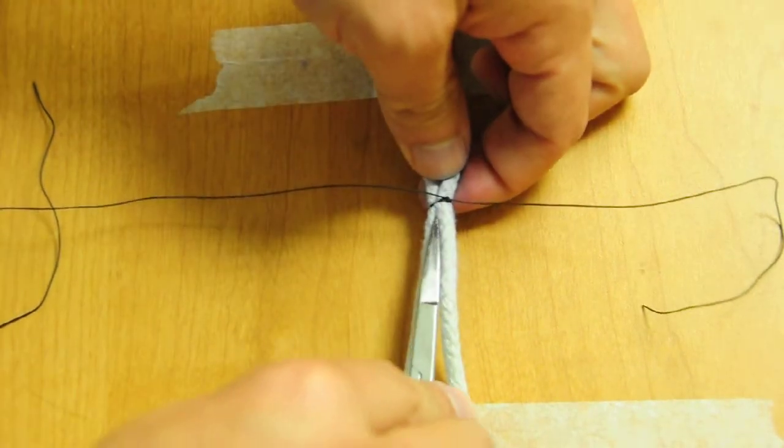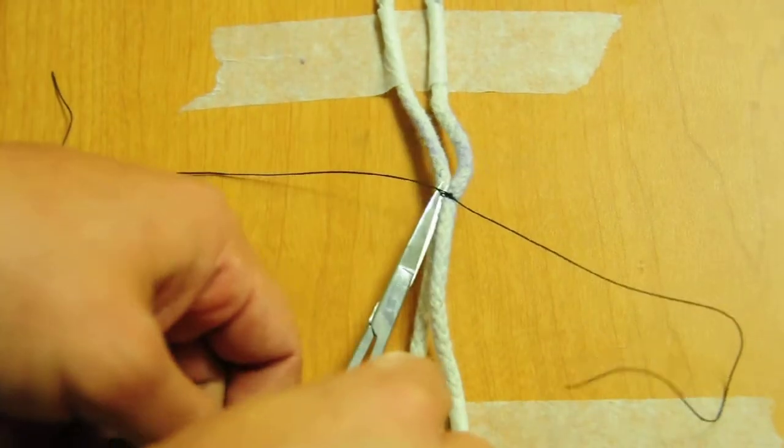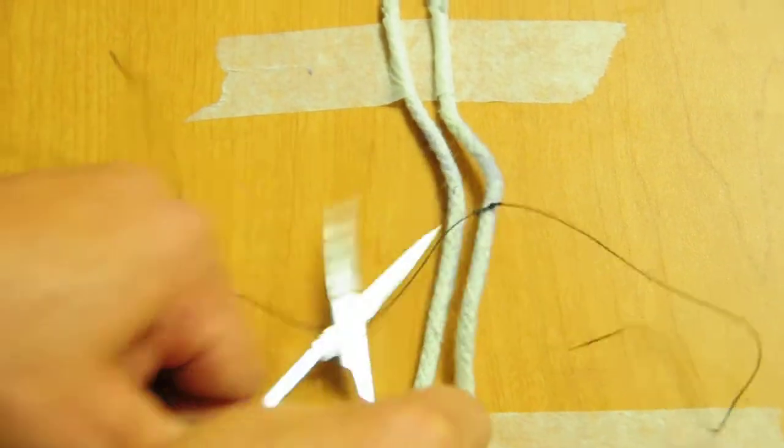Let me test your suture here. Oops, don't cut it. And again, it breaks before it slips.